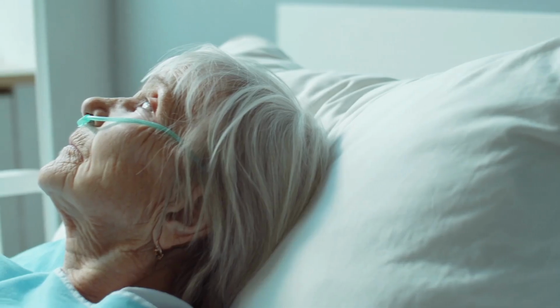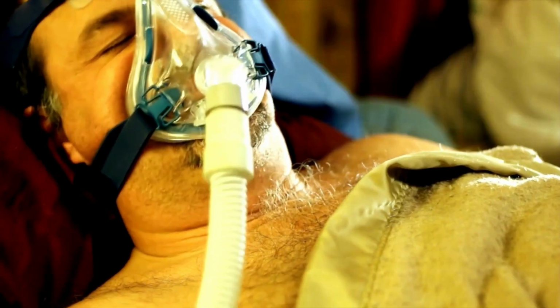So let's just say your patient walks in and they require 5 liters nasal cannula, 6 liters, and then throughout the night they start to progress in the wrong direction. So we go from 5 liters to a face mask to a non-rebreather, and now they need a CPAP or a BiPAP, and their oxygenation is still not appropriate. They're still sitting at 85, 86. You decide to draw an ABG and the ABG numbers are off. Your next step is going to be to invasively ventilate somebody, so put them on the ventilator. Call that RT, get them over there.